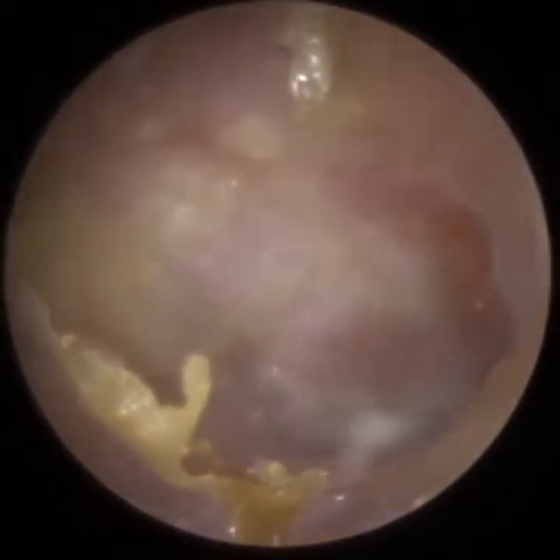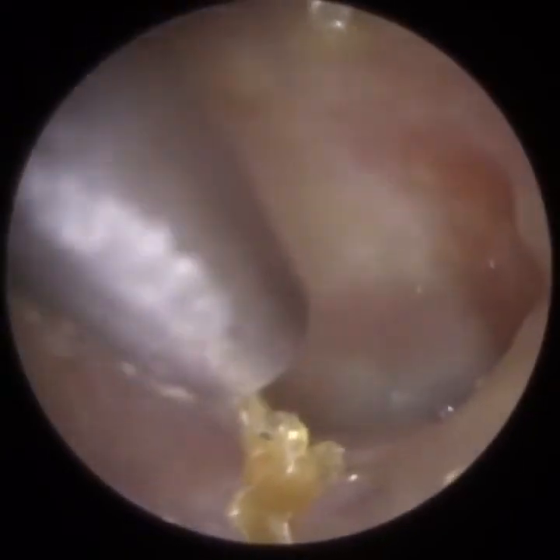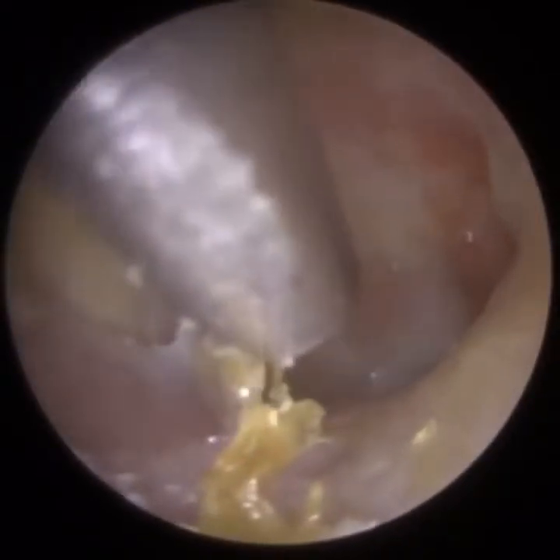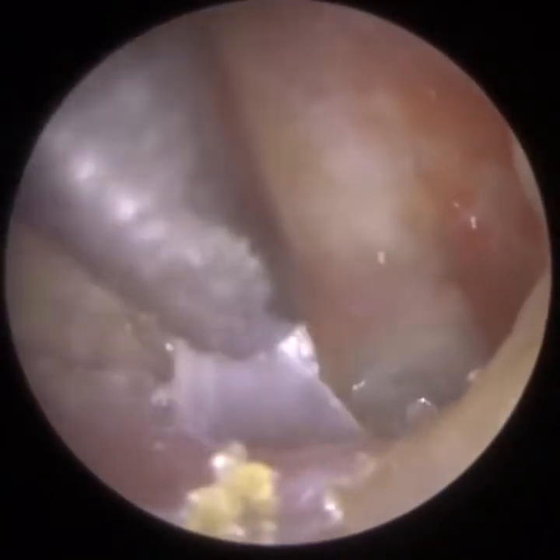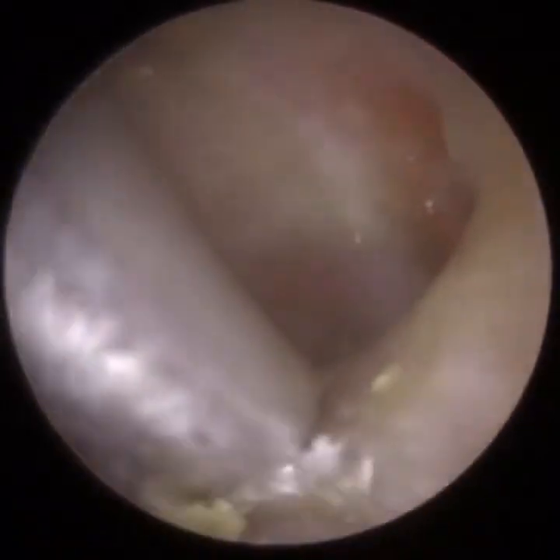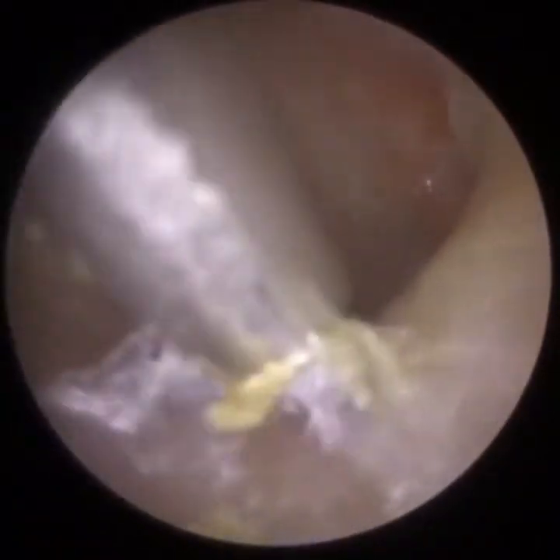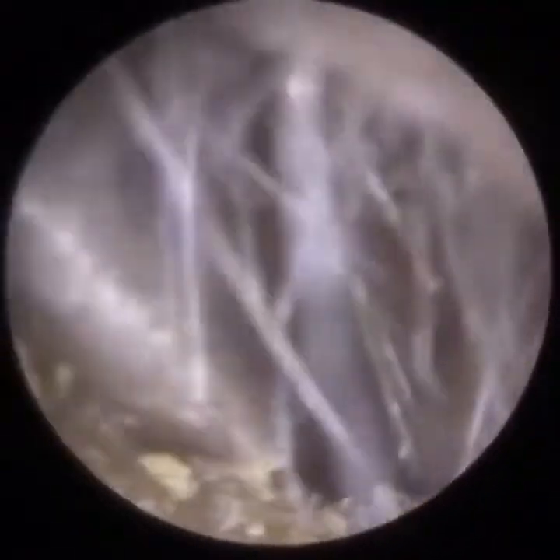I'm just removing that. And in the inferior recess, it's almost like a hideaway. It's a trench, as I mentioned before. It's very hard to visualise inside that. You can probably see that at the moment where we are now. The ear canal suddenly drops where the skin is, it goes down. And you can get a substantial buildup of dead skin. In a minute, you will see me remove a huge amount of dead skin. And it'll be very surprising when you see it, because you'll be wondering where did all this skin come from? Because it's not visible to the naked eye until we peel it out of the inferior recess.